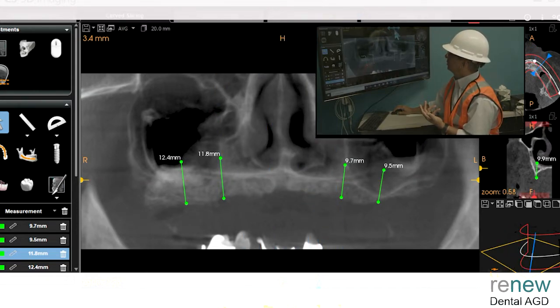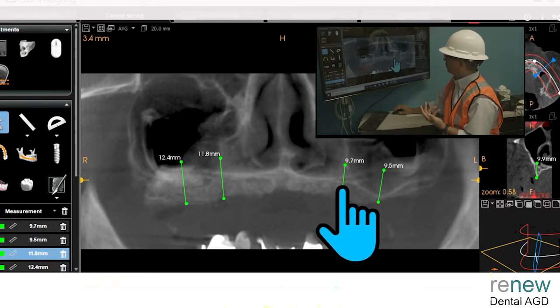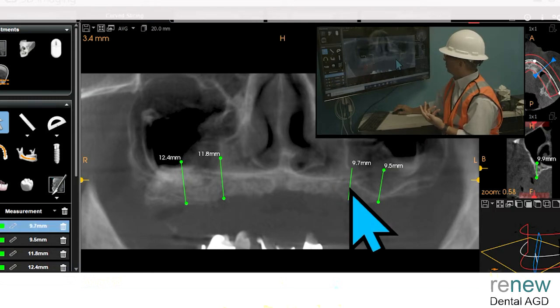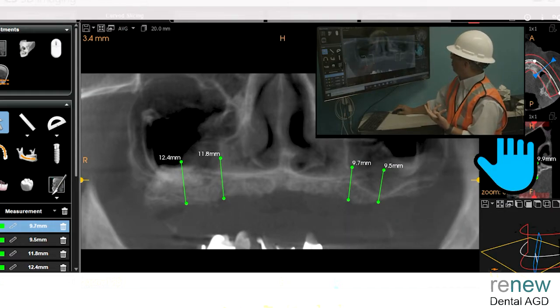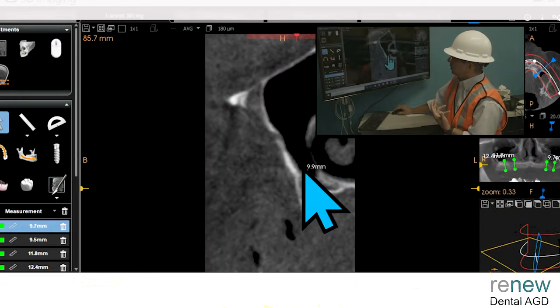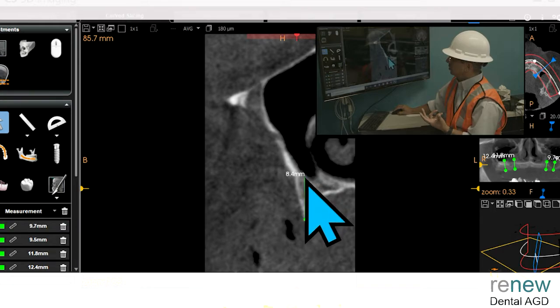We're going to probably have to do something more like that. So these get closer. That might be an overbar piece or something holding it in. You've got very thin septal bone again on the upper left side. You've got not a lot of bone going upward.